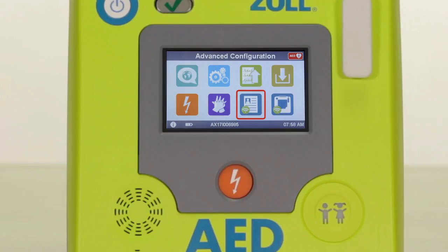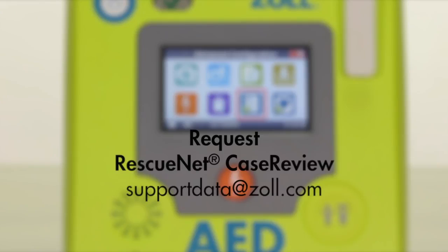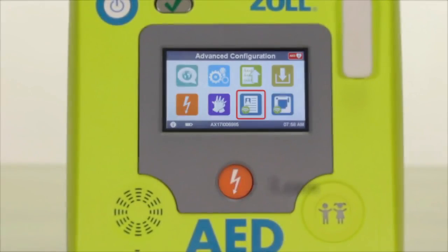The blue report icon with the green Wi-Fi waves icon is where you set up your Wi-Fi connection for transmission to ZOLL CaseReview, should you wish to access case data such as ECG and CPR performance. Note that you will need a CaseReview account to do this. ZOLL offers CaseReview Basic free of charge for AED3 users — you can request a free account by contacting ZOLL support at supportdata@zoll.com.